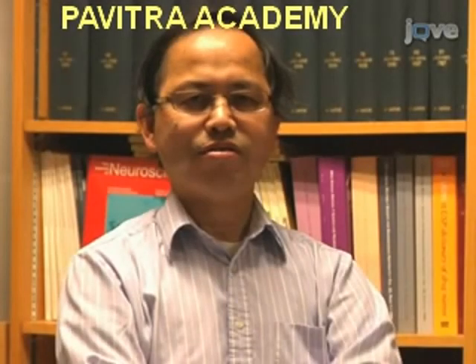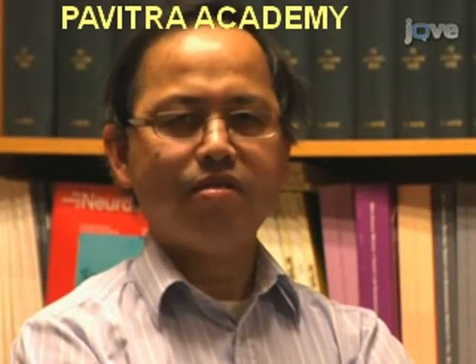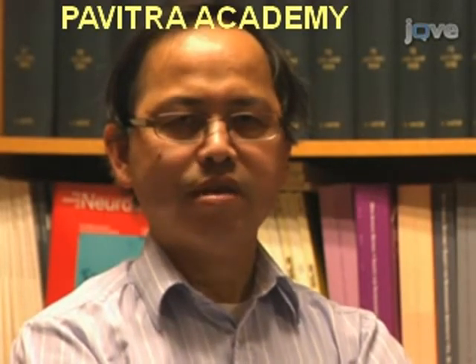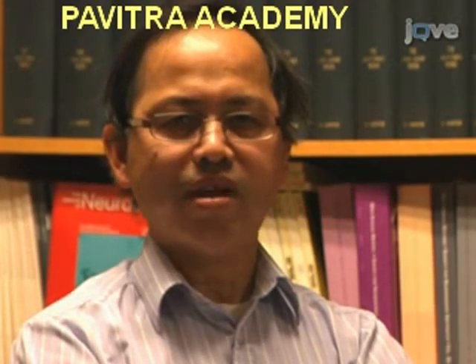We have just shown you how to monitor the dynamic effect of acupuncture on the human brain using fMRI. When doing this procedure, it's important to remember to pay attention to the subject's comfort and psychophysical response, aiming to generate De Qi and avoid noxious stimulation.